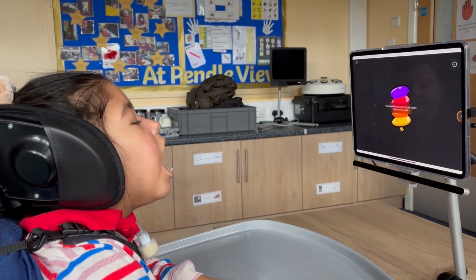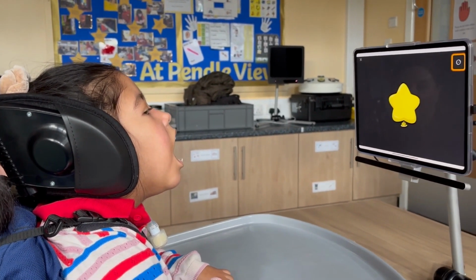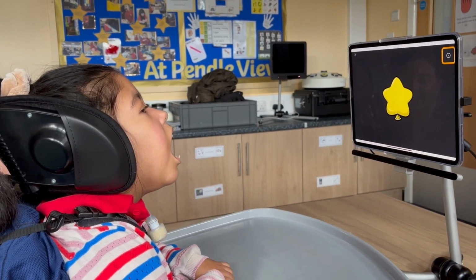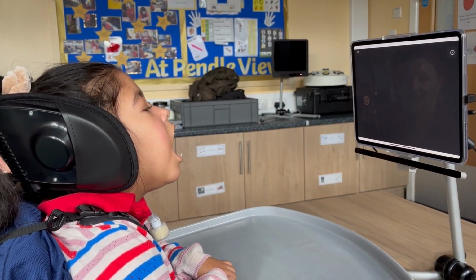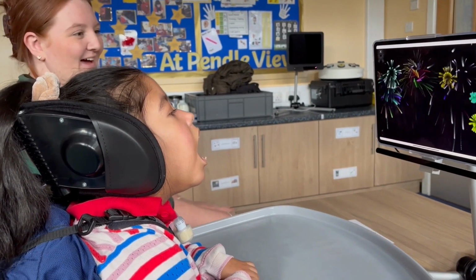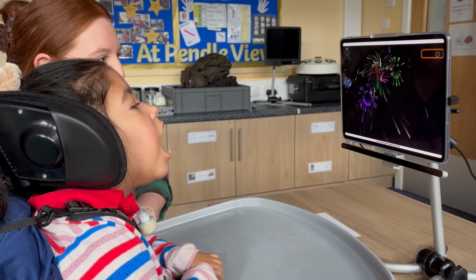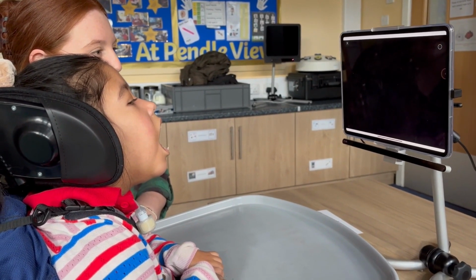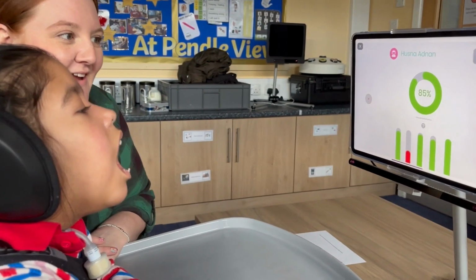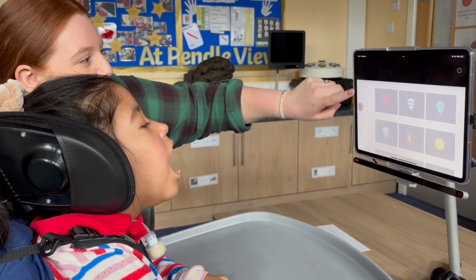You can see Husna's looking in the center of the screen as those objects appear. Another thing the teacher was saying was Husna was able to notice images as they appeared in the middle of the screen, and her scores were improving each time, which as we go throughout the video, we'll certainly see. Really good. Look at that. My goodness, 85% results on Insight there. So we'll carry on.